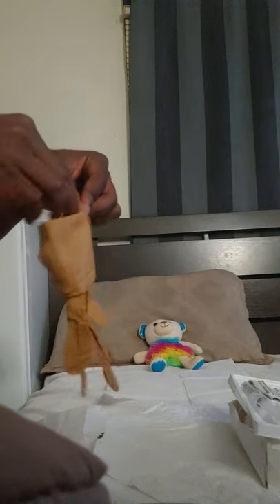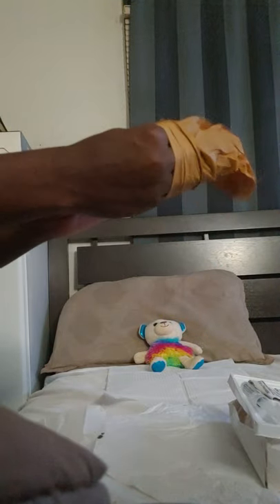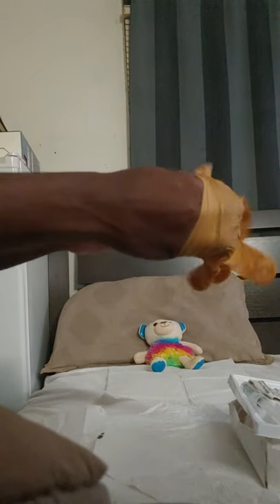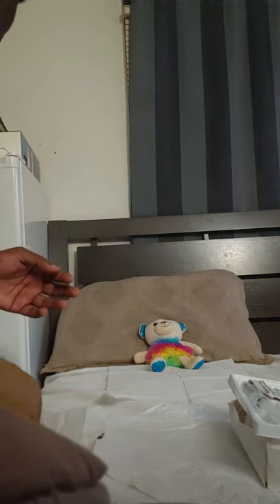Take out with your non-dominant hand. Working in, working in — don't touch the outside of your gloves, always the part that's folded. Now I'll pick up the other one, put my hand right here, out at the edge.